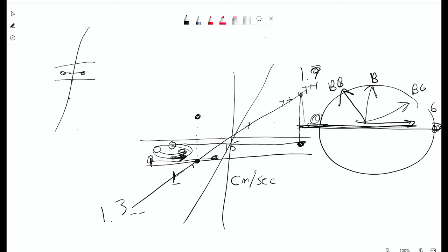That's what's so cool about the phase contrast technique: you can actually tell the direction of the flow. You'll notice in your phase contrast technique, I've got my magnitude images, I have my rephased images, and I have my phase images. The magnitude image is just going to be anything that's moving fast is bright, doesn't matter what direction it is, whereas phase is going to take in the direction.